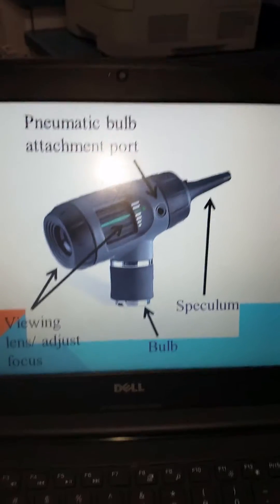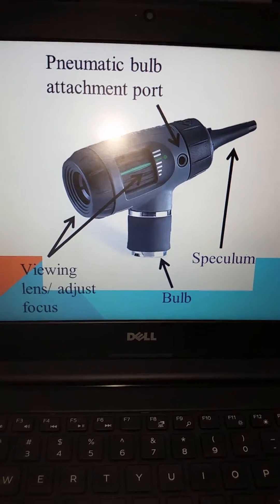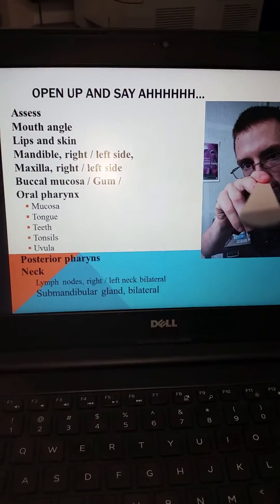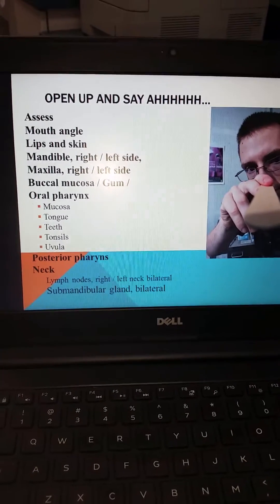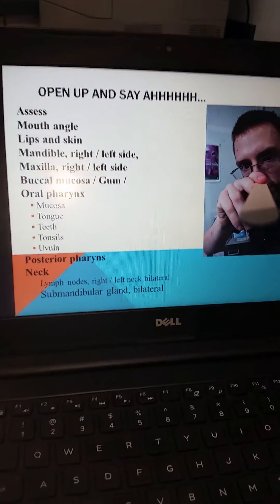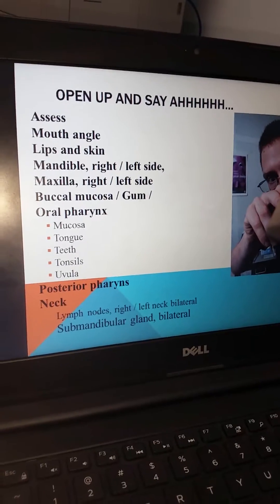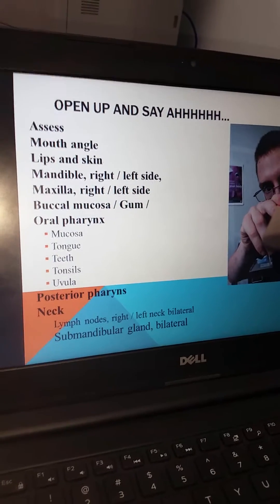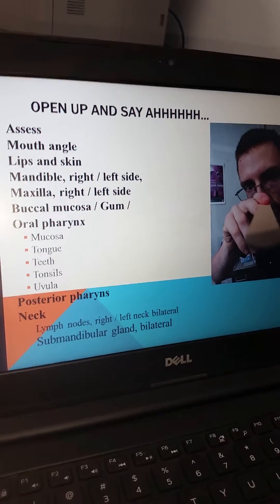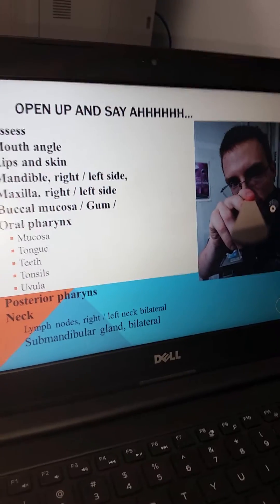Remembering that we're using our primary tool of the otoscope and its pieces and functional parts. Our examination is going to assess the mouth angles, the lips, the skin, the mandible and maxilla on the right and left hand side, looking at the buccal mucosa and the gums. Inside the oral pharynx, you're going to be looking at the mucosa, the tongue, the teeth, the tonsils, the uvula, and the hard palate. The posterior pharynx can be commented on for erythema or cobblestoning.